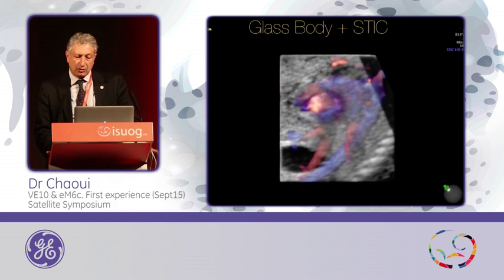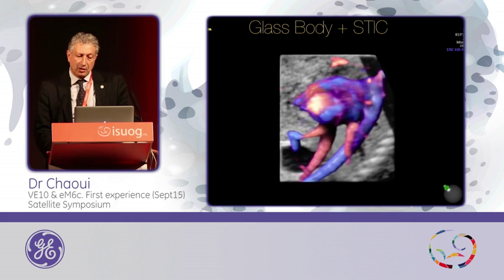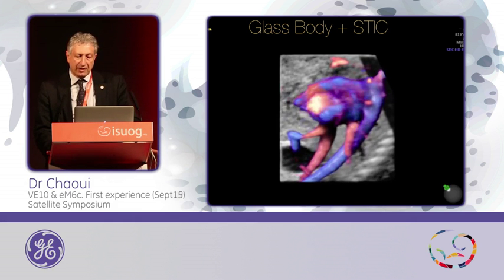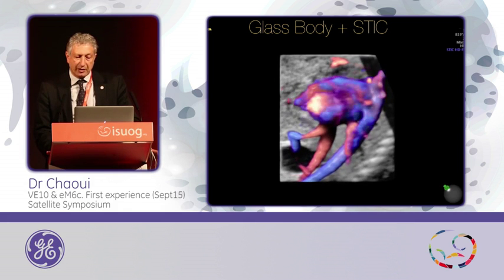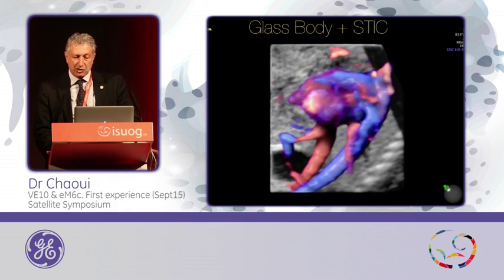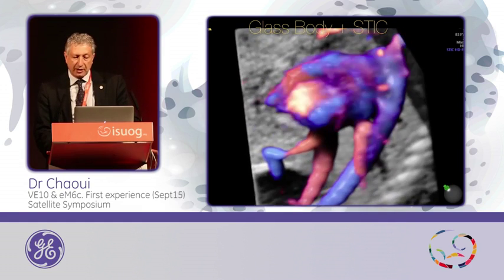Using here, as you see, this torch, you can change the direction of light. And this is how the vessel appears. You see the pulmonary vein, the descending aorta, the inferior vena cava, the ductus venosus. This is a projection where you can recognize the relationship of the vessels to each other.